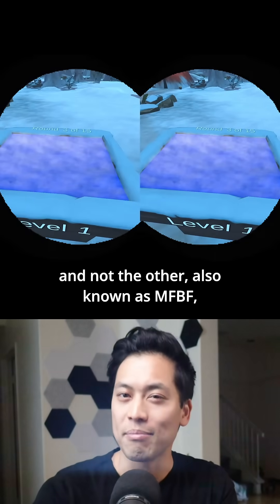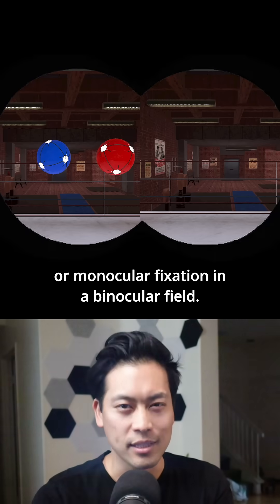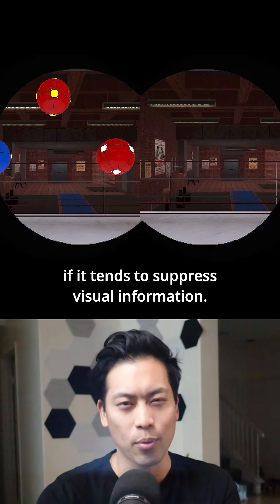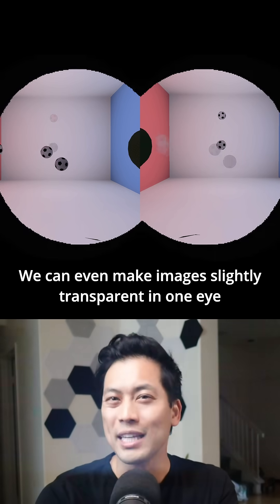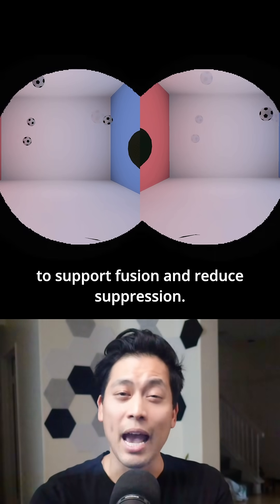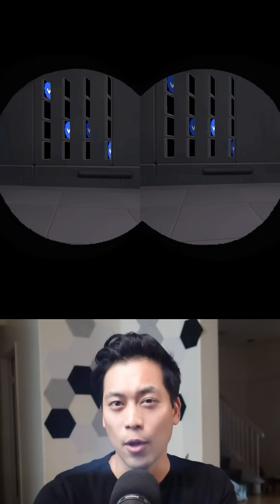Also known as MFBF, or monocular fixation in a binocular field. This encourages the weaker eye to engage if it tends to suppress visual information. We can even make images slightly transparent in one eye to support fusion and reduce suppression.